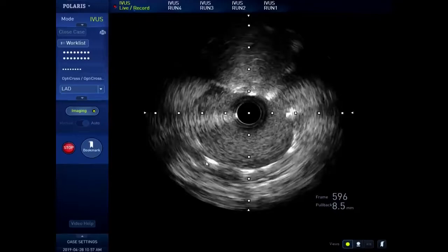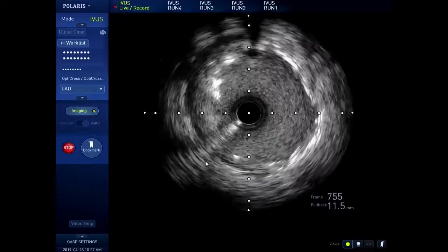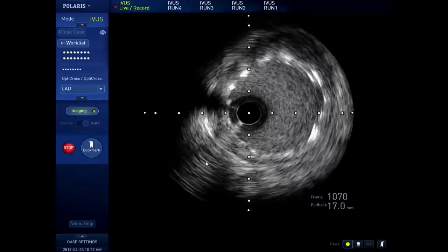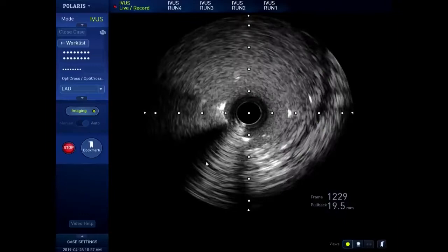This is coming, the ostium. Oh, nice. That looks perfect. It's a wider offer. Well, that's what you would expect. Looking at this left configuration, I think we don't need additional re-wiring. It's widely open. I would just do measurements, but I think the left main looks great. It's fully covered, the left main ostium. Yes, a couple millimeters into the aorta, but that's okay.